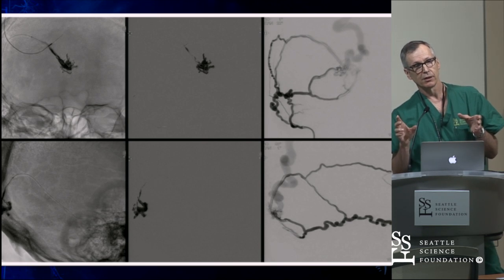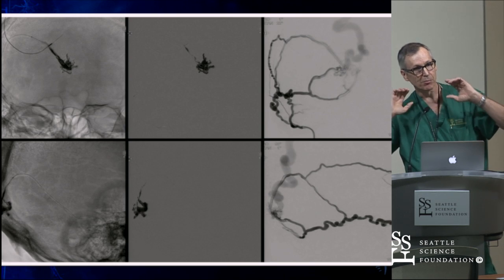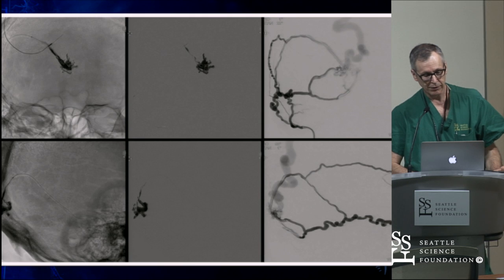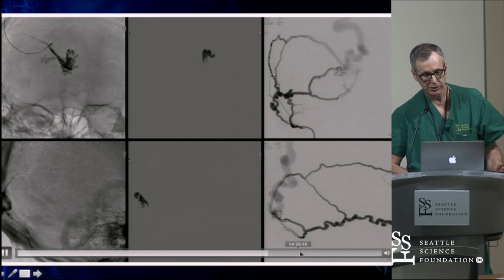And Onyx is bad because, as you talked about it flowing like lava, there's often lava tubes in there. So there's hollow areas in the middle. It'll coat all around, and there'll still be flow through the middle. And if I can find it on this slide, I'll show you some of that, because we're stopping every once in a while and taking pictures.